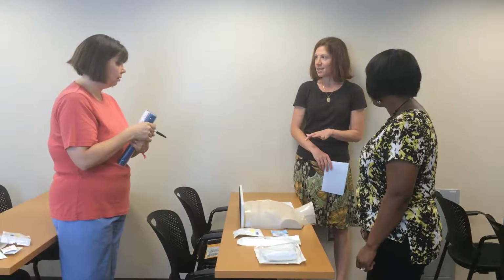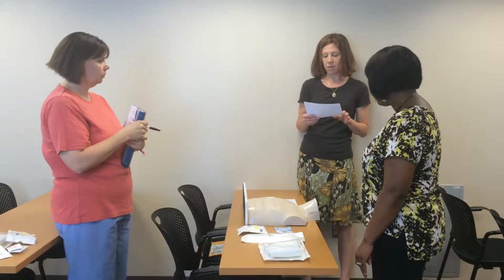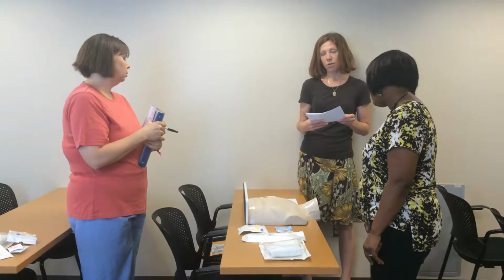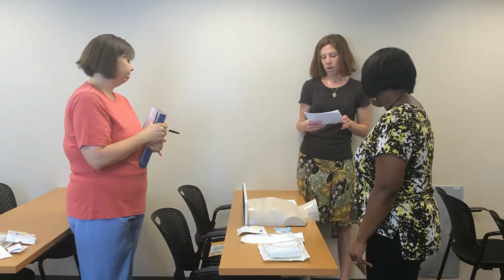Ashley and Susie, I appreciate you being here so much today to work on this simulation scenario about accessing a port for an oncology patient. Before we begin, I just want to remind you of a few things. The scenario will take about 10 minutes for each of you to do. And while Chester Chest is not a real patient, I've provided some details about your patient, JG, based on information from real patients that we see on 4Oncology.